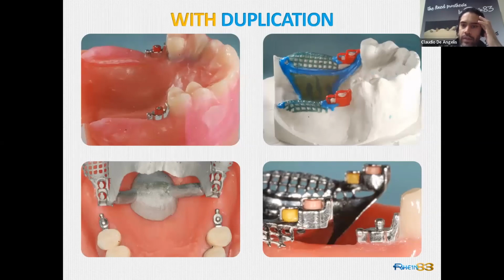You are a lover of duplication; you do not trust doing it in one way. You just produce the metal crown with the attachment as we said. You put the ring on top of the vertical sphere, you duplicate the model, you transform it in investment, and you place your castable box on top of your duplication.